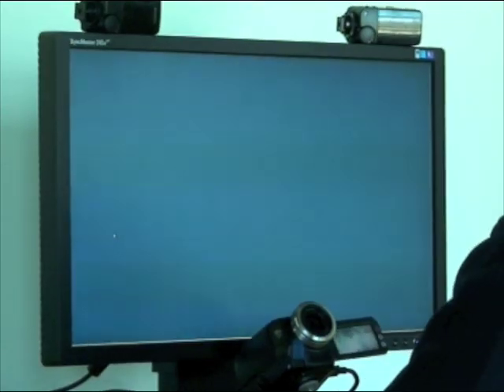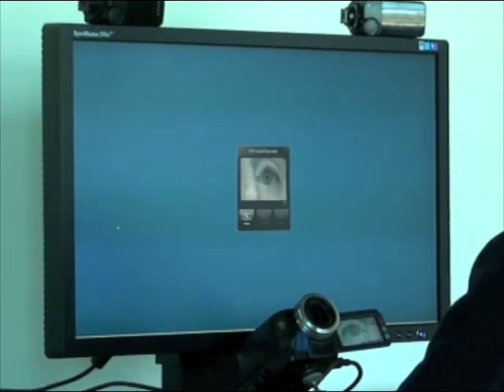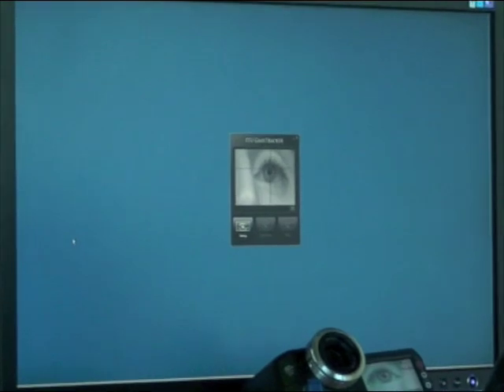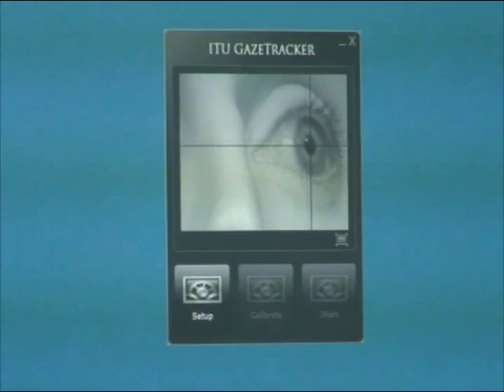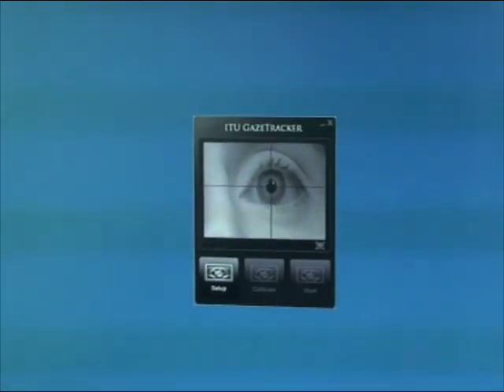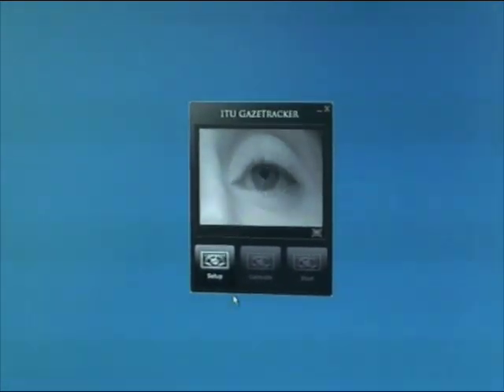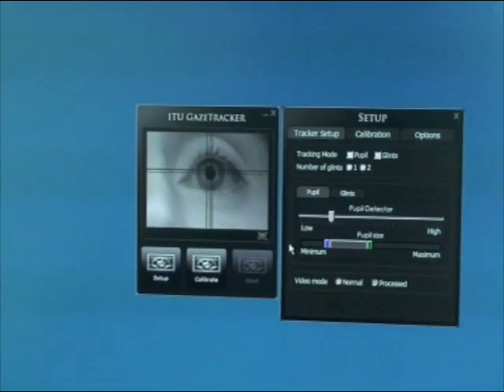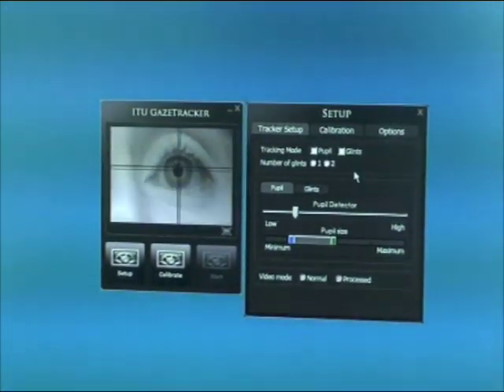When we launch the ITU gaze tracker we are presented with the main application window. This shows the image of the eye if the head is correctly positioned in front of the camera. When we launch the application the only button that is active is the setup, which will launch a setup window where we can tweak the parameters of the eye tracker.